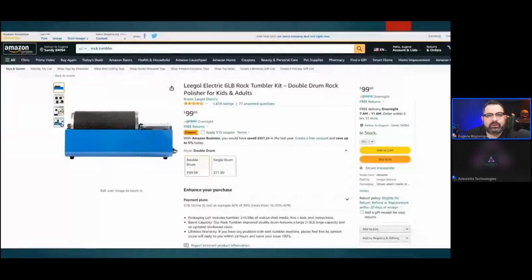So when you mix your resins, a lot of resins you need to tumble for quite a long period of time, especially if they're highly filled ceramic resin. And they sell dental mixers for that. What I have found, and actually I haven't found this, somebody showed this to me, are these rock tumblers. They work really well. This top portion right here, these are just drums you take out, and the round bottles of resin fit really nicely in there. Pretty much all the sizes I've used so far fit in there pretty well, and you can just turn it on and it will mix resin for you.